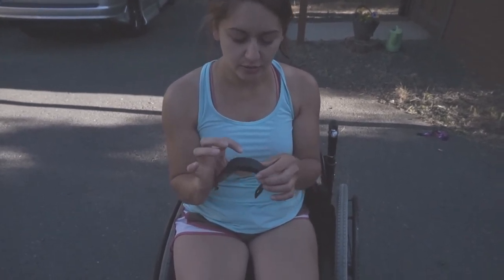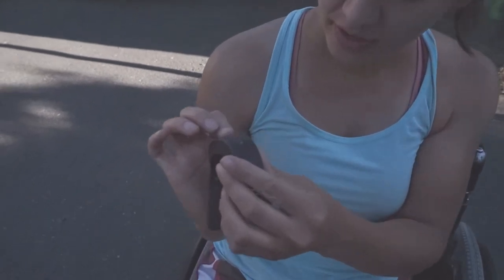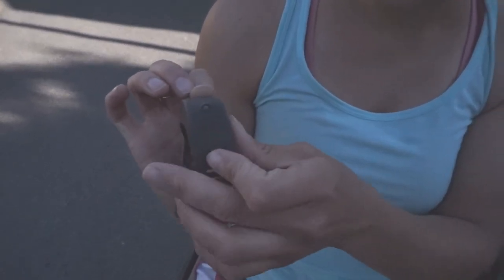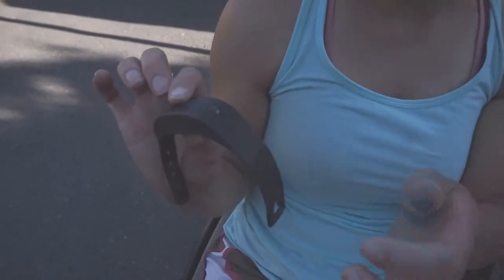So this is the bracelet. It's an older model — probably one of the first models they had for this. You hold the button down and it will turn on. It's flashing blue, so the battery is at least somewhat charged. You hold it down and it will turn off.